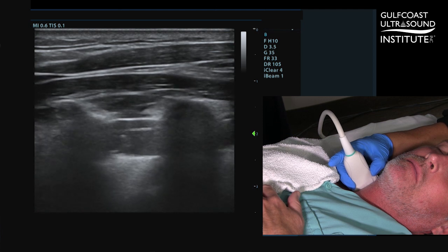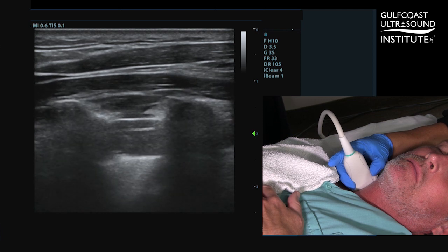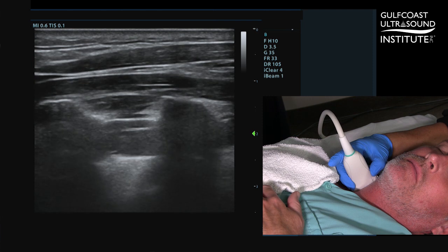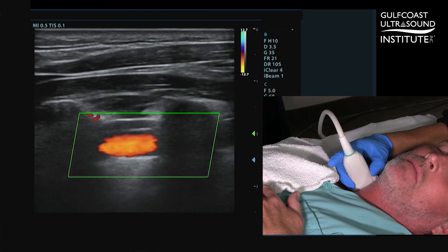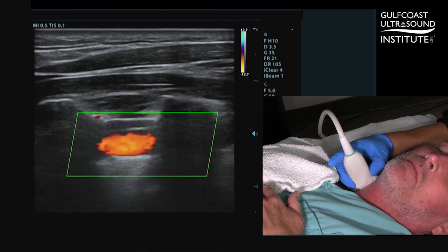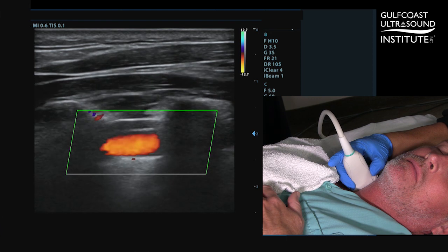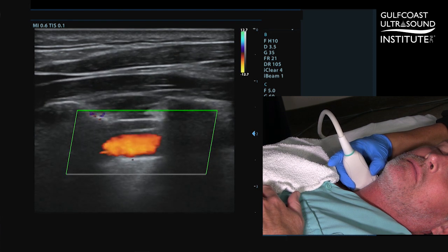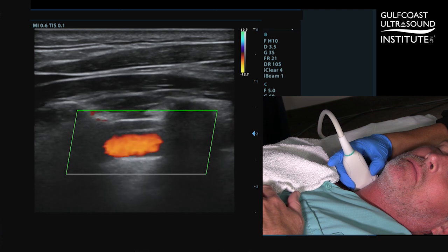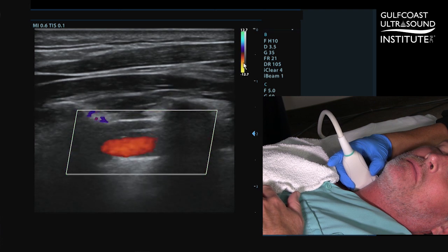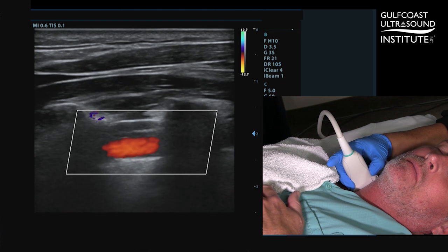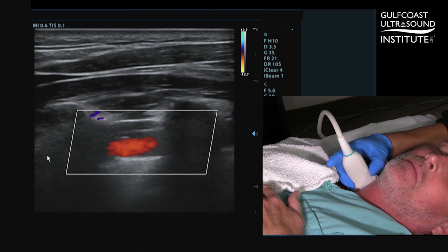Once you have located the vertebral artery, evaluate for flow direction. We'll do this by activating our color Doppler and moving the color box over the vertebral artery. Now identify the color of the vertebral artery — indicated here by red. Your scale shows that red is moving away from the transducer, towards the head.